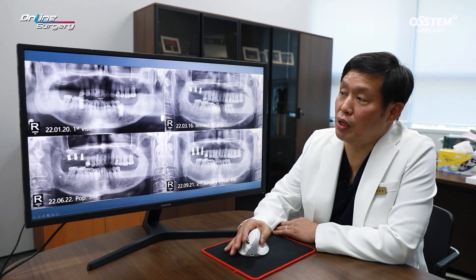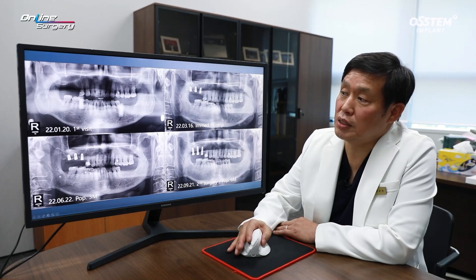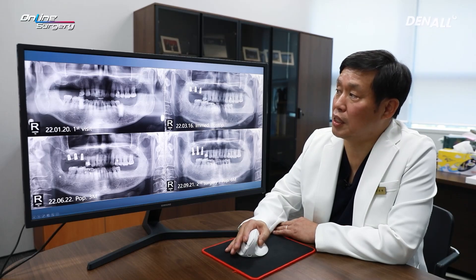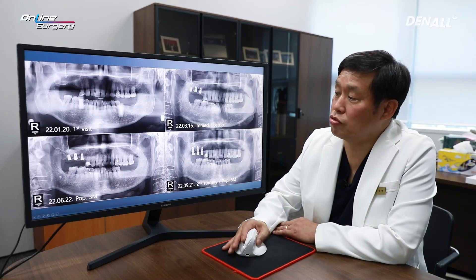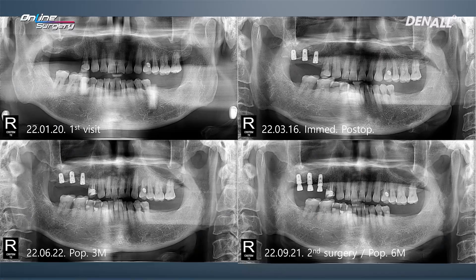Comparing the images from initial visit, right after surgery, and three months after surgery — the second surgery was performed. This is the panoramic image at post-op six months. At the time, ISQ value was not measured.